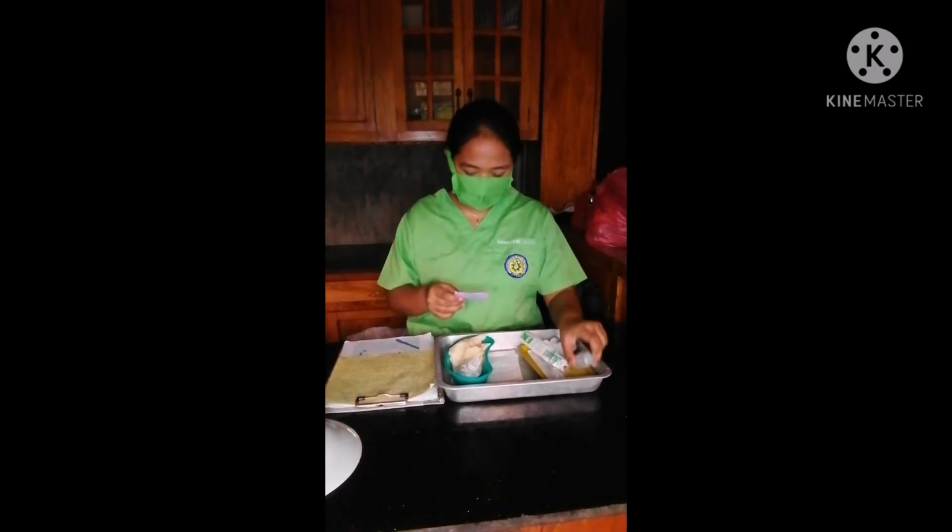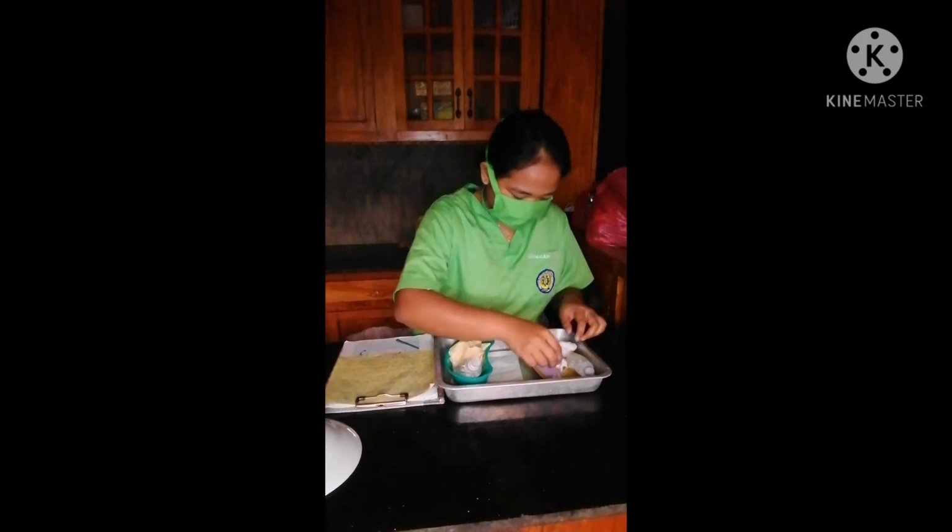Compare the label with the MAR, check the expiration date, and perform calculations if necessary. If necessary, withdraw the medication from an ampule or vial as described in the previous skills.